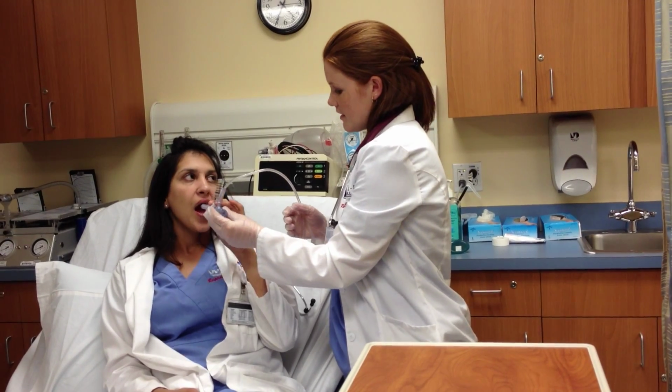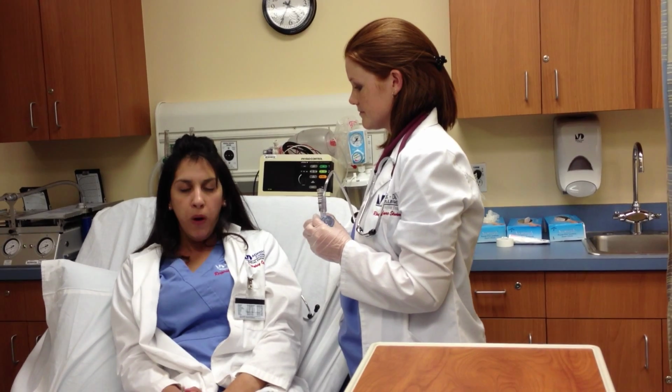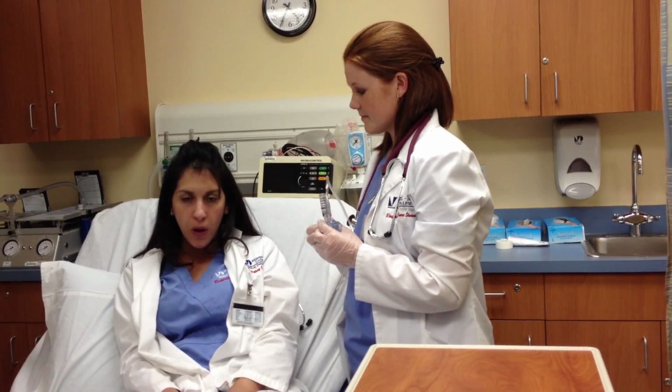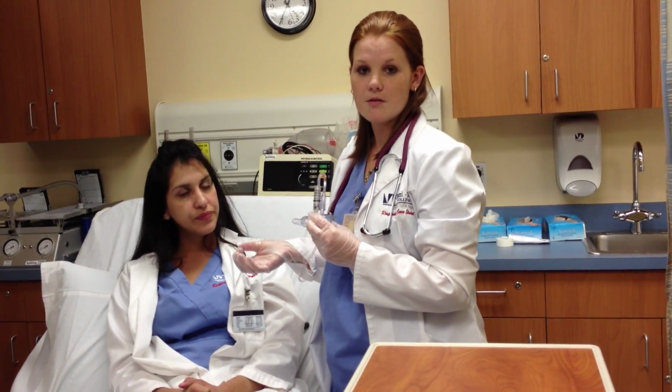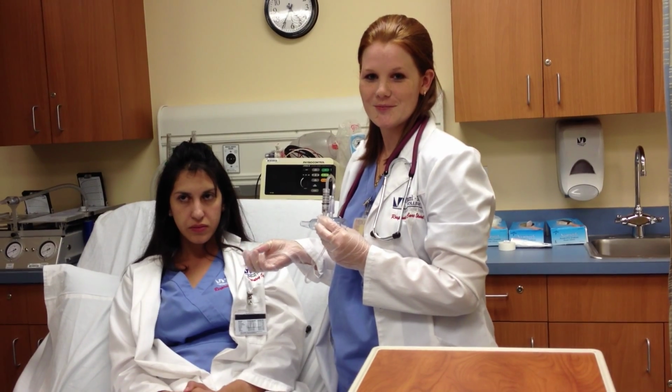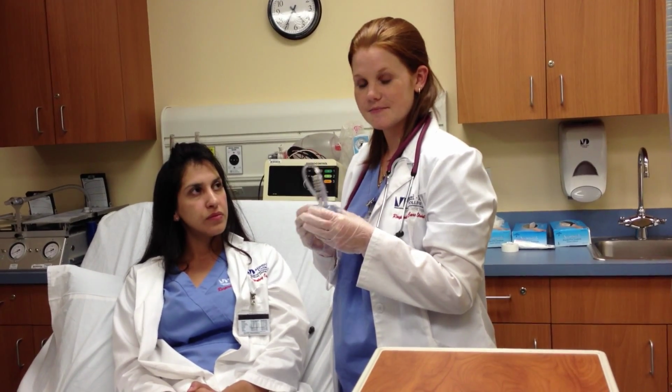After that, I would ask my patient to demonstrate 2 to 3 huff coughs. If your patient is able to cough anything up, you make note of the color, the amount, the thickness, and if there's any odor. You do this procedure 4 to 8 times within the next 10 to 20 minutes.